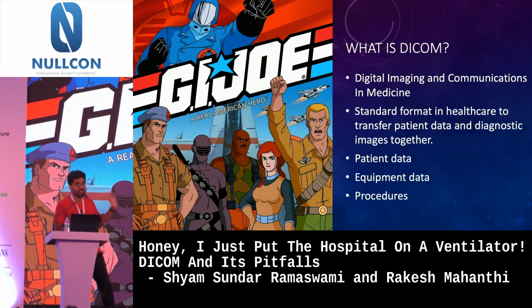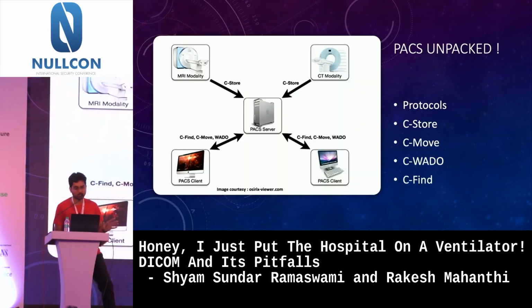Now, we have the digitized format, but we have to move it around, right? Well, congratulations, you have something called PACS. Picture Archiving and Communication System allows you to move these files like your HTTP GET and POST methods, right? You have to send a file, receive a file, send a packet. Similarly, there are protocols that allow you to send.